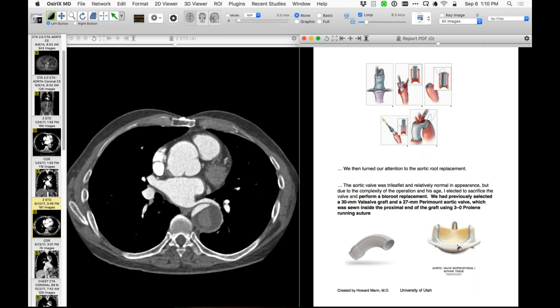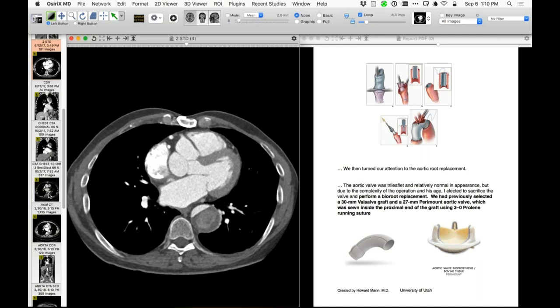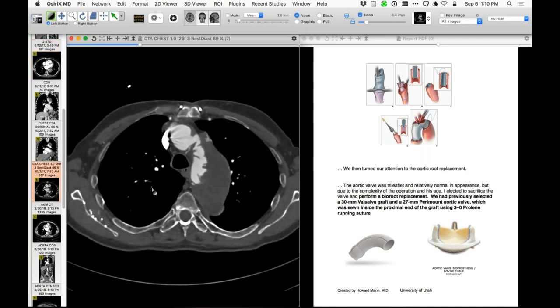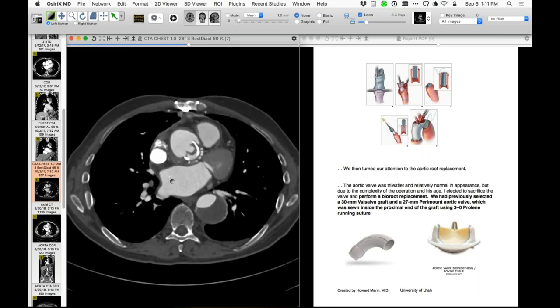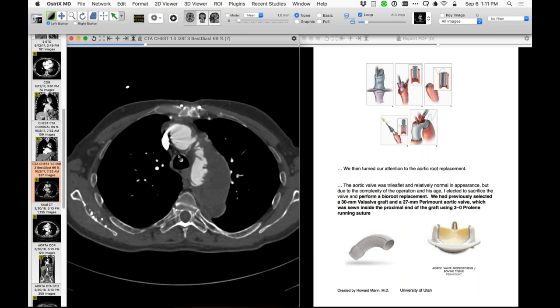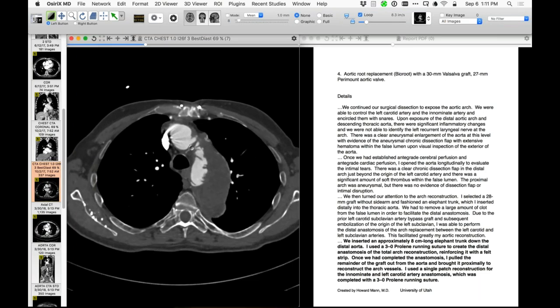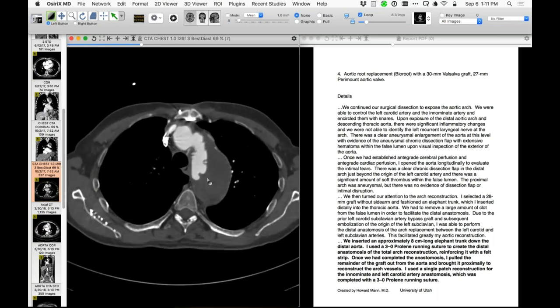For the aortic root, they used a Valsalva prosthesis and a Perimount aortic valve. On follow-up exam, we see the aortic valve bioprosthesis connected to the Valsalva graft. With the operative record, I was able to determine that the distal anastomosis is reinforced with felt, and this particular appearance is the elephant trunk — a little redundant and floppy — but that is the elephant trunk portion of the procedure.